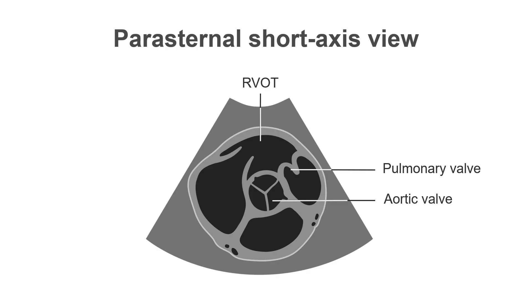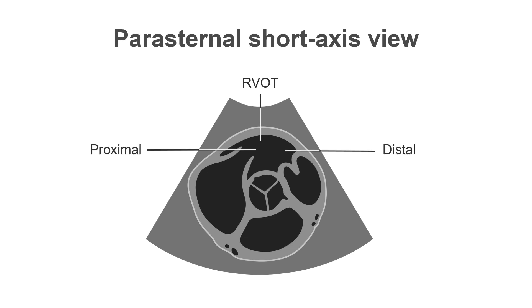Looking at the parasternal short axis view, we are now at the vessel level, where the pulmonary and aortic valves are both visible. In this view, the right ventricular outflow tract is seen at the top of the screen and can be measured at two levels: proximal and distal. Both measurements help us understand if the right ventricle is dilated or normal in size.